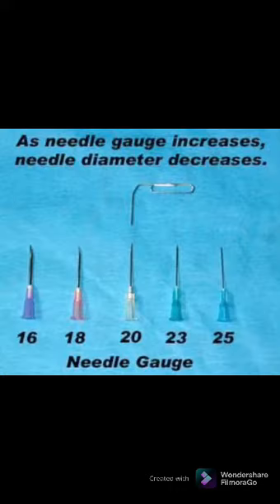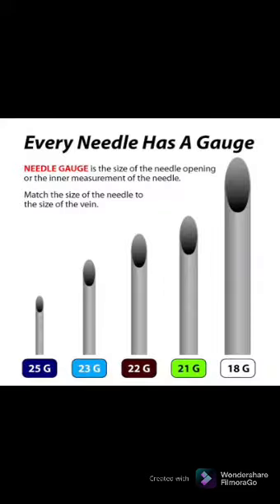Needles and needle gauges. The different needle gauges are 15 to 17. These needle types are attached to collecting bags. These are used basically for blood donation and therapeutic phlebotomy. Second, the 18 gauge. These needles are also known as the hypodermic needles. They are used primarily as a transfer needle rather than for blood collection.